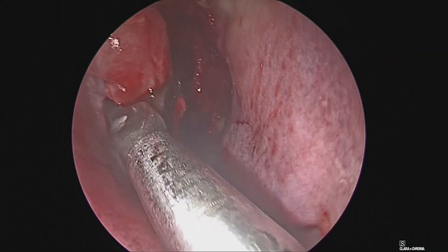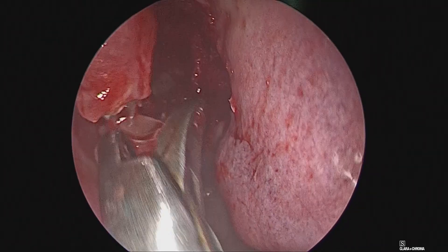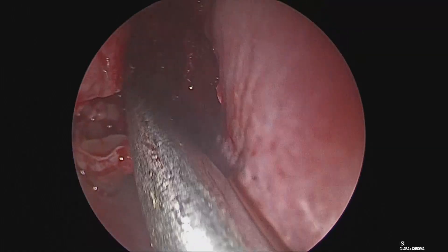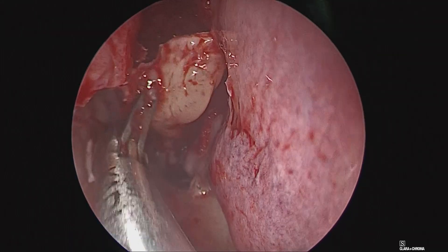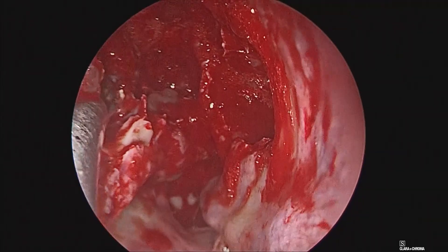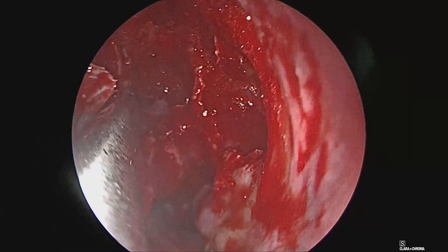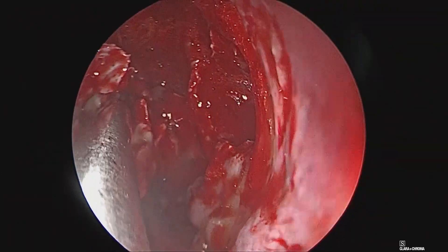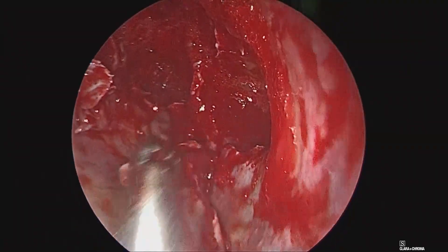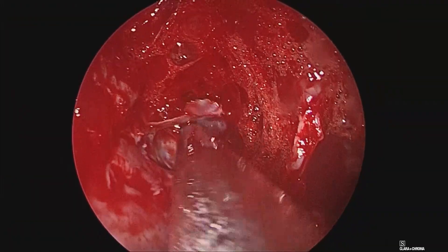To gain access toward the sphenoid and make it amenable to high-volume irrigation, we use a through-cut to resect the inferior third or sometimes even half of the middle turbinate. This provides a wide straight-ahead access toward the sphenoid sinus. The goal is not just to open the sinus, but also to maintain its patency and facilitate high-volume irrigation — fundamental to avoiding recurrences and relapses of fungal disease. The turbinate has been pedicled posteriorly and the sphenoid is now being opened.